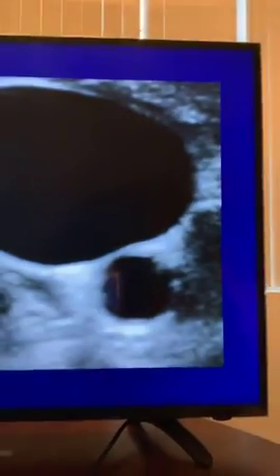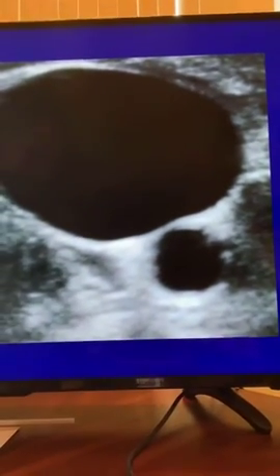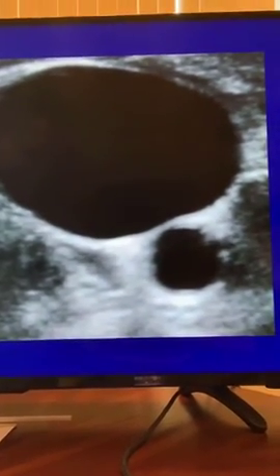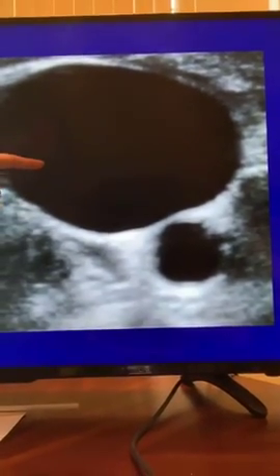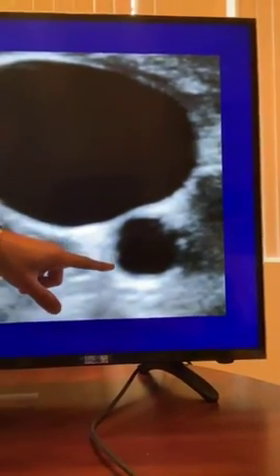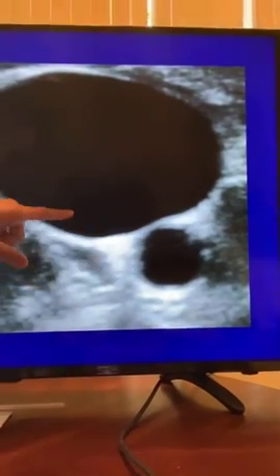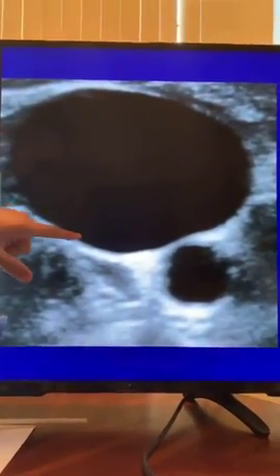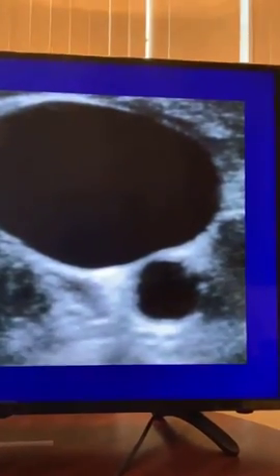Oh, I did have this image. Look at this image right here. This is what I want you to see every single time you're going to place an internal jugular line, a central line. This is the patient's IJ, right? Huge IJ, carotid smaller. You can see the wall of the carotid is really thick. Veins don't have that thick wall, that muscular layer, all right? So this is what you need to see every single time.